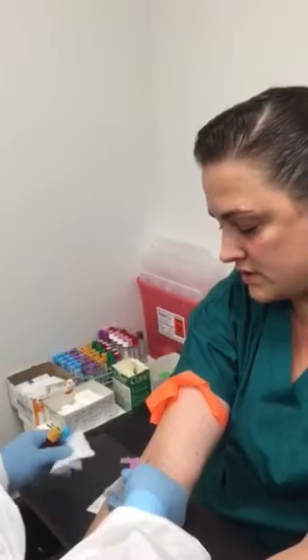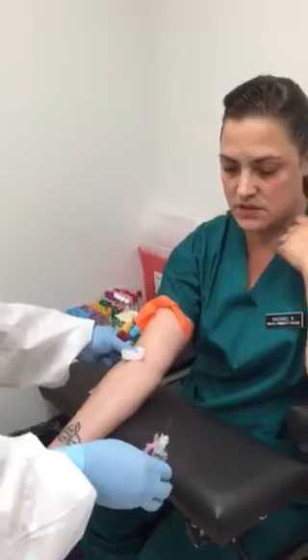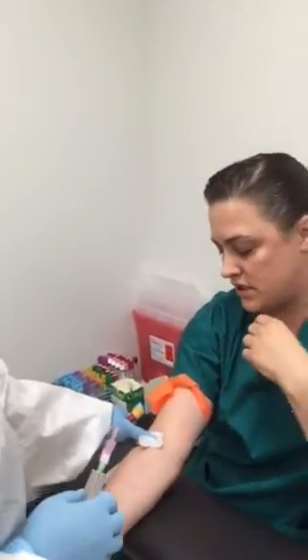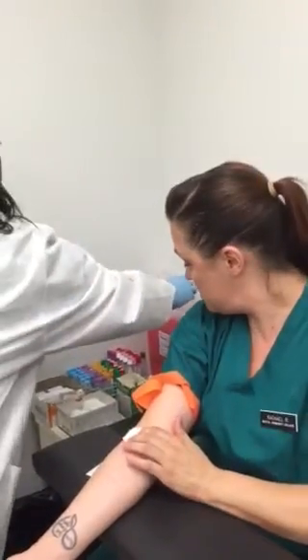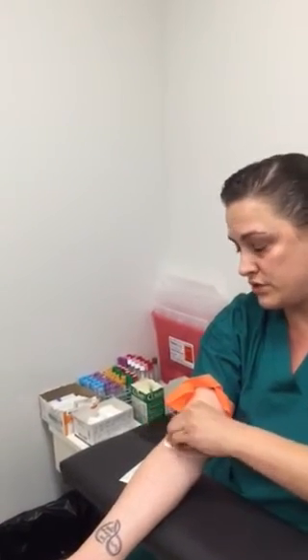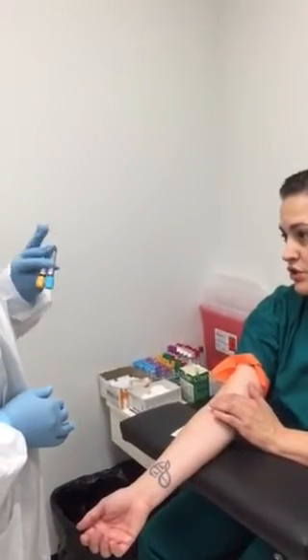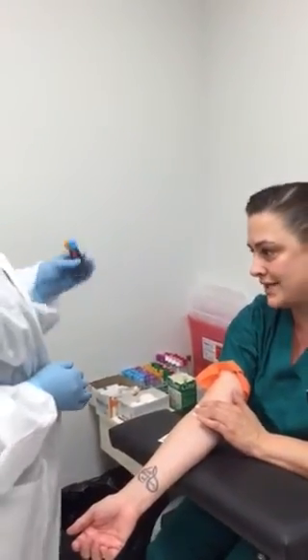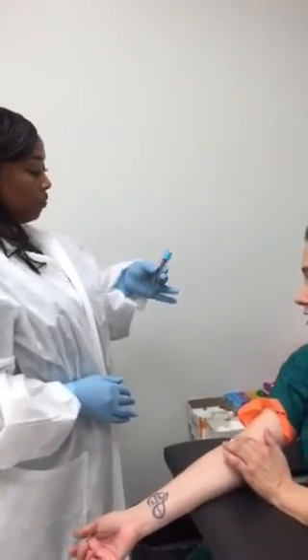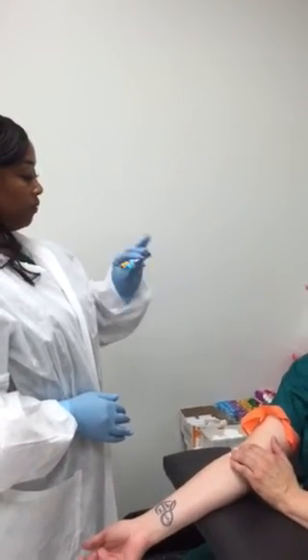She's going to grab her gauze, put it over the needle site, pull out the needle, and engage the safety. Discard the needle in the sharps container. Make sure to apply pressure while inverting the tubes. Make sure you invert anywhere from five to eight times. Do not shake vigorously because this can create hemolysis.